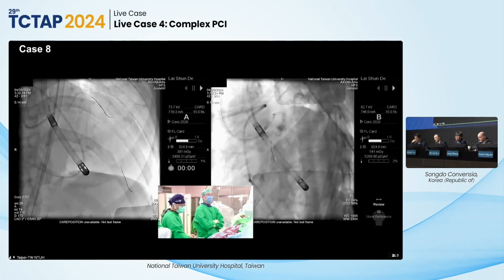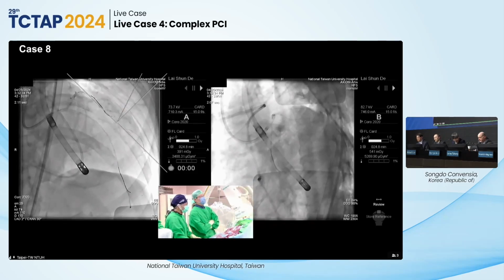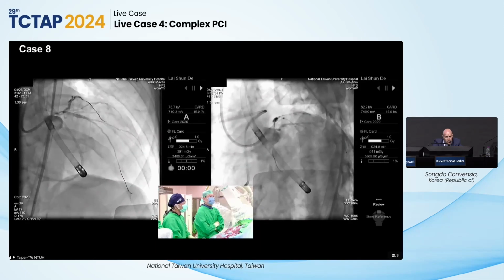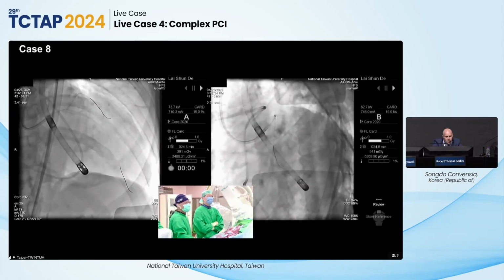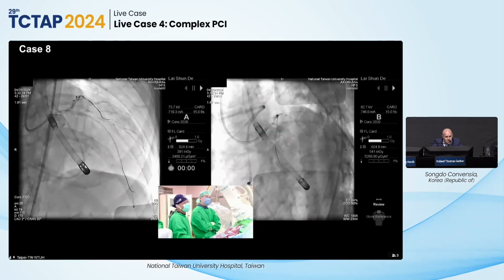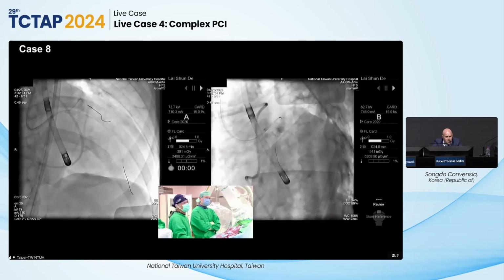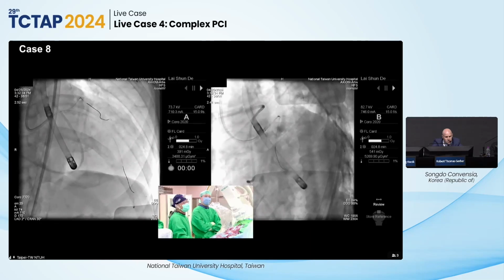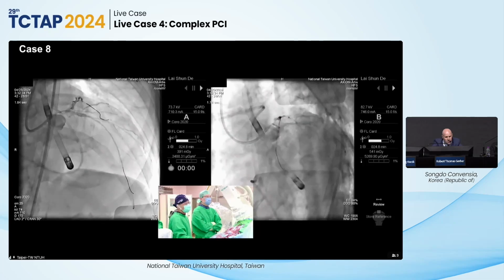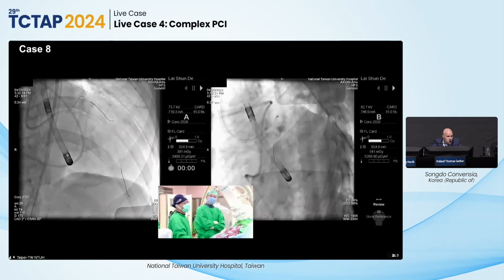I mean, one option would be not to put too many stents in here because he's a diabetic who smokes, and maybe just stent the LAD into the left main and DCB the circ. Just because my concern is the more stents you put in this guy, he's smoking and diabetic and calcified, they're all going to restenose. So you want to minimize that maybe, and you could always bring him back for surveillance angio, say 6 months, and the vessels may grow. DCB might be an option.